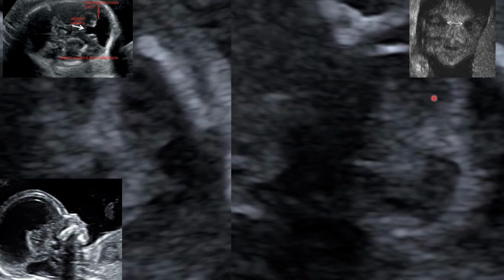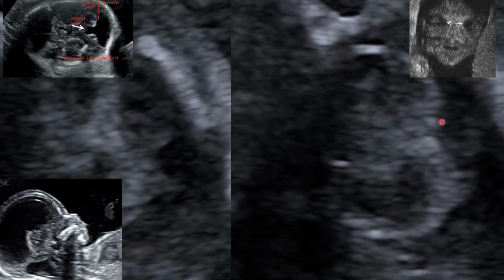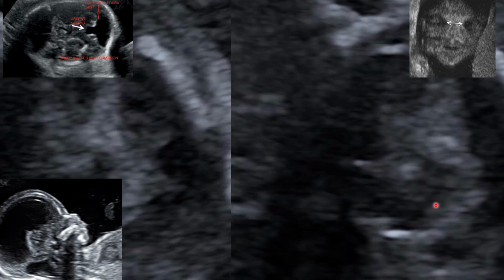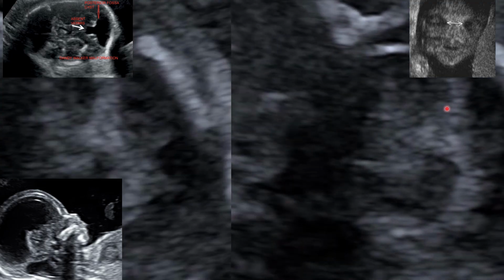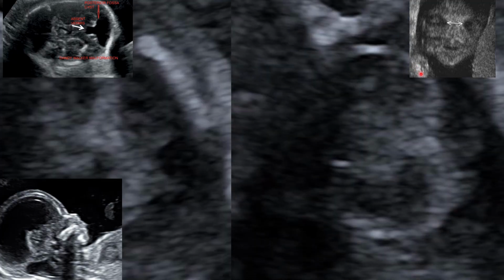This screening you should do in the second trimester, but you can also check it. We don't just do anatomy scanning or screening in the second trimester. You can do it also in the third trimester. You must keep on checking the anatomy every time. But the detailed or the normal scan is done in the second trimester.